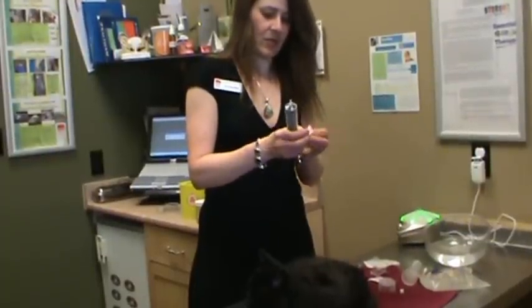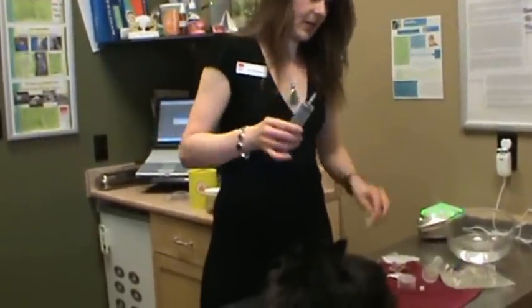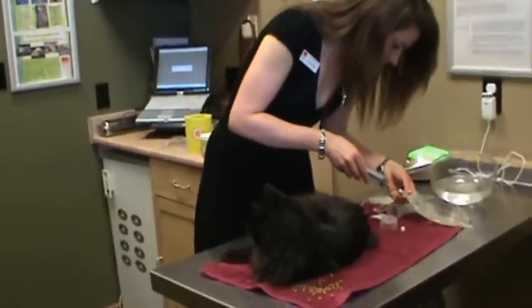Then I basically put on a fresh 18 gauge needle and suck it up. Tracy brought over the vitamin B injection, so we're going to use that.